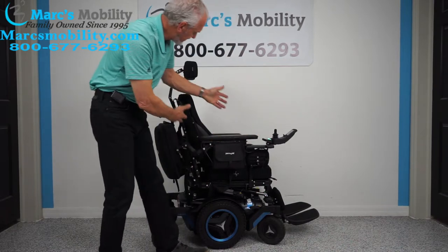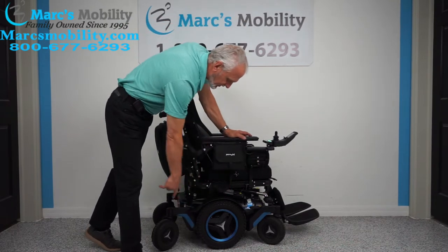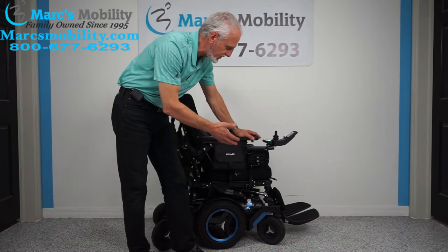This chair has 41 miles on it and was used for about 2 months. As you can see, it's practically brand new. It has the aggressive tires, so it's got the outside tires, but you can also use this chair inside.